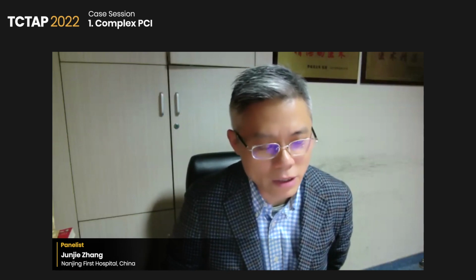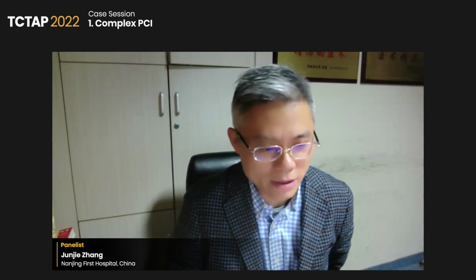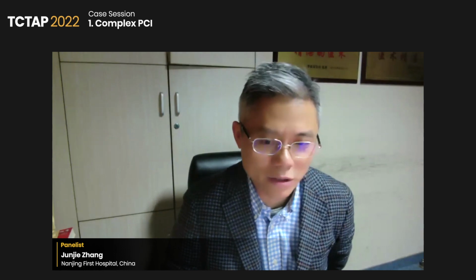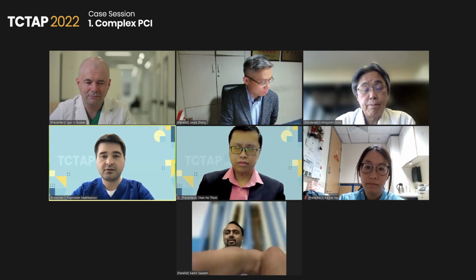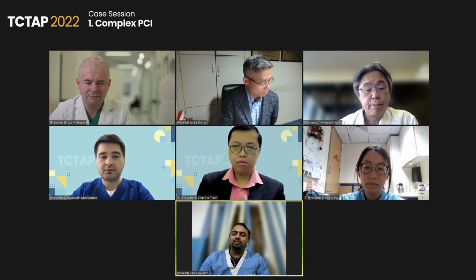It's a very smart strategy. So the final result is quite good. Congratulations. Thank you very much. If you have questions, I will be happy to answer. From myself also, congratulations, good case.